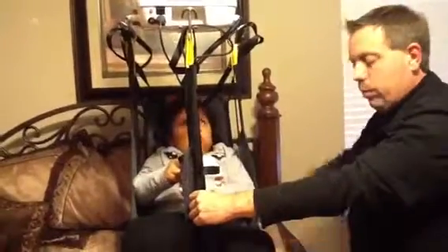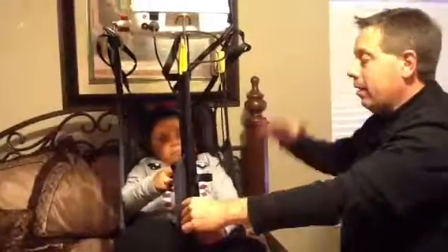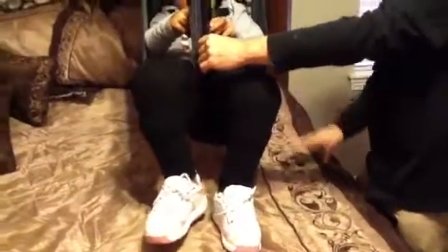Her legs wouldn't have been as high up. This bed is not an adjustable height bed, so we need to get her up as high as possible.